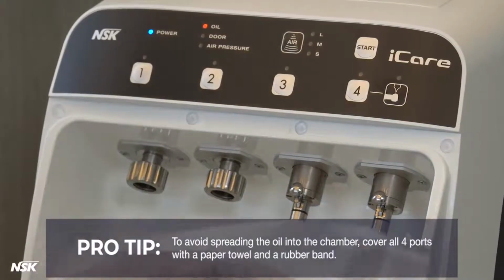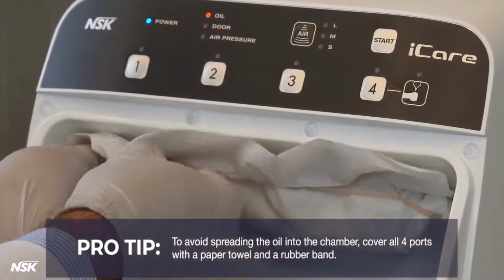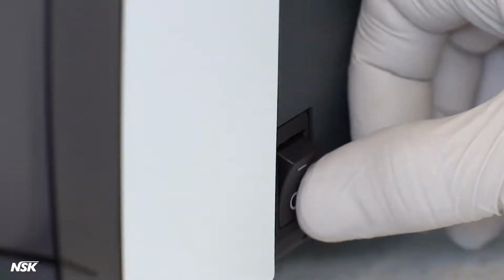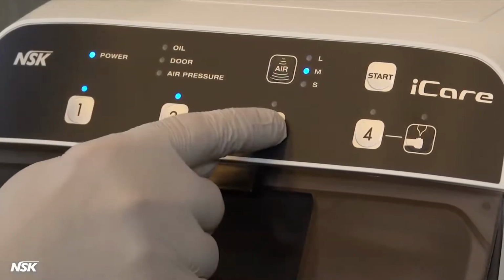For the next step, use this pro tip. To avoid spreading the oil into the chamber, cover all 4 ports with a paper towel and a rubber band. Close the front door. Turn the power switch off and turn it on again. Press each number button to activate all 4 ports.